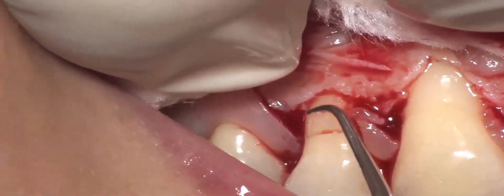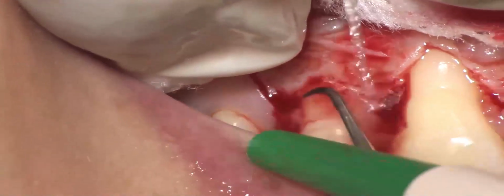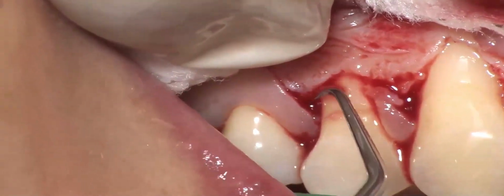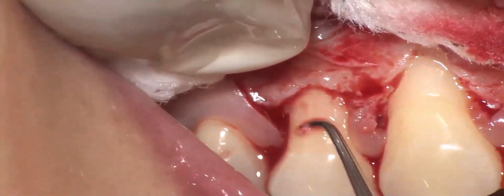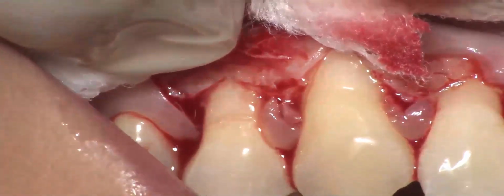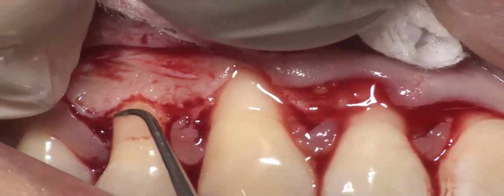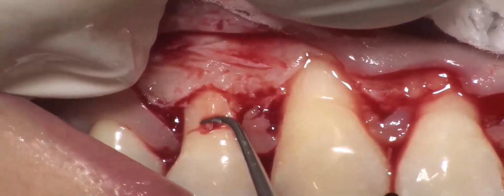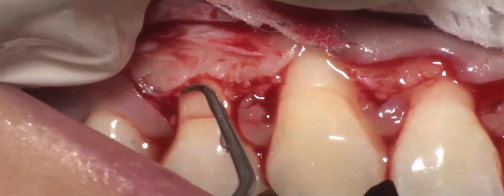Change the extremity of the curette to make root planing of the distal portion. When you hear the difference in the noise of the dentin that is going to be planed, it means that the root is ready.